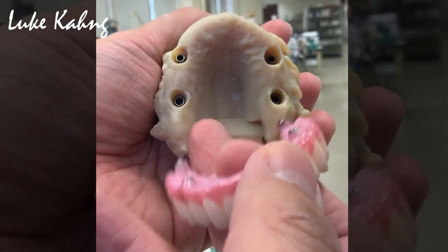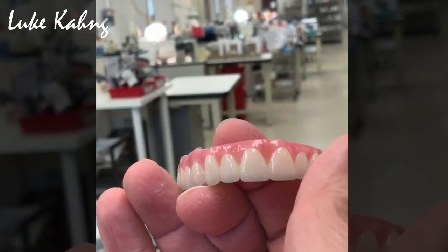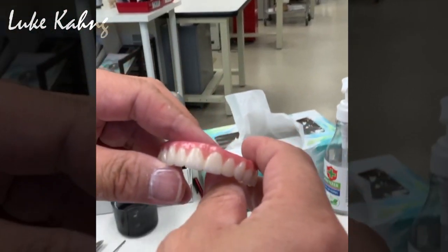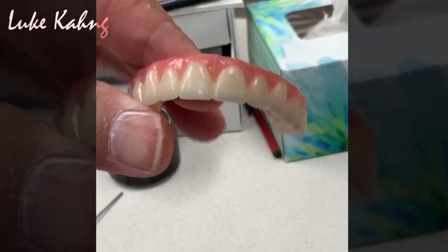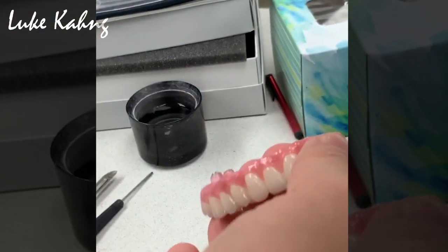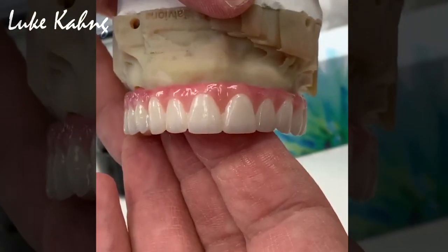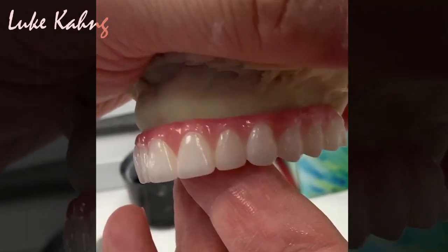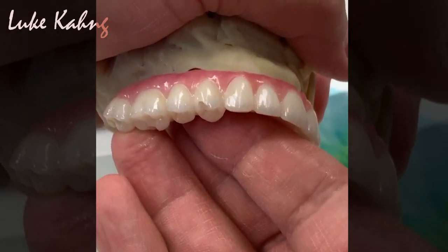I think today's is the most tough case. It's long span. So we finish it. It's very tough case. So finish it monolithic because it's too big. And just make sure the whole way fitting. Then we send it to the doctor's office. That's pretty tough. Alright, just best we can. Alright, cool.